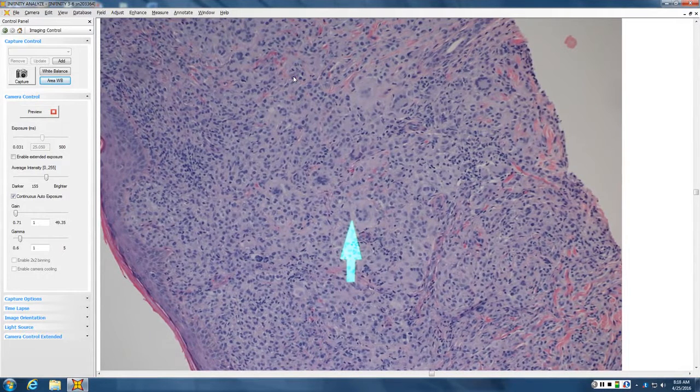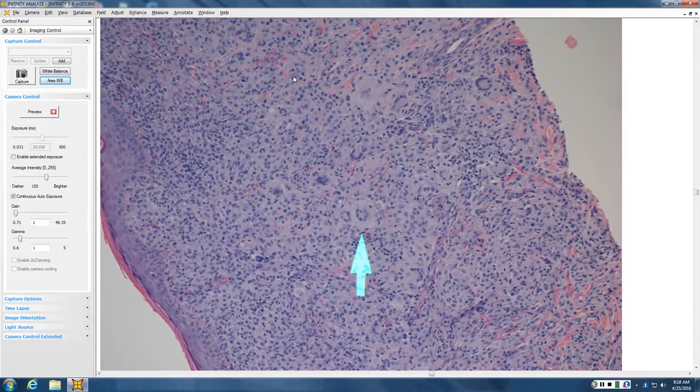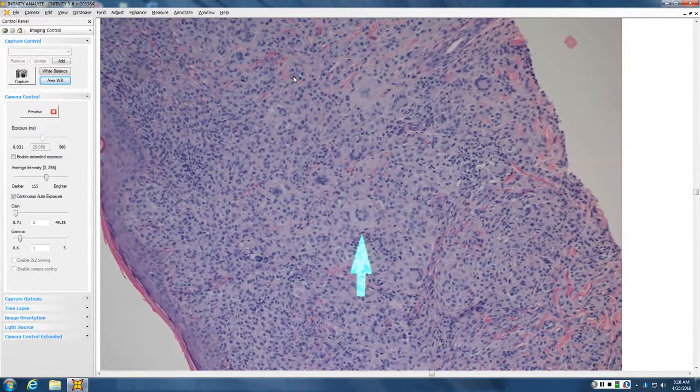A xanthogranuloma. The two-tone cytoplasm, rosier and paler cytoplasm, goes with either a Spitz or a histiocytic type cell. In this case, you see two-tone giant cells, which are wreath giant cells with lipid peripheral to the wreath, and that would be typical for a xanthogranuloma. Here they're in the center, usually they're at the top and the bottom. They're usually at the periphery. Xanthogranulomas start with just sheets of gray histiocytes, then wreath giant cells form at the periphery, then they lipidize.